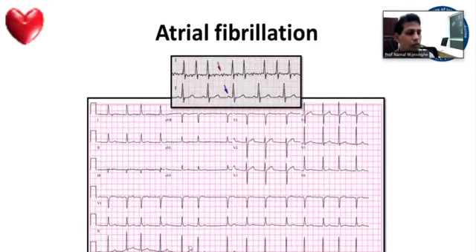So here you have 1, 2, 3, 4, 5, 6, 7, 8. You multiply that number of QRS complexes by 10. So here the heart rate is about 80. If you want to be more accurate, you take 60 squares and multiply by 5. But it is difficult, so you take 30 large squares, count the QRS complexes inside, and multiply by 10.